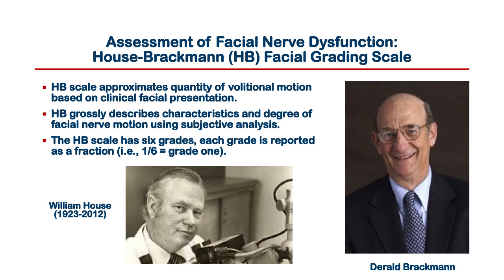Okay, now ENoG is performed with an evoked response system which has electrical stimulation. It's a very technical way of assessing the facial nerve, and in my opinion, extremely valuable. You can get information from ENoG you can't get any other way. And the otolaryngologists are not doing ENoG, so they're counting on you to tell them, is this nerve totally degenerated? And to monitor the patient to determine whether there's any return of function, because looking at the person's face and asking them to do things with their face, like smile or close their eye, only gives you a partial picture. It doesn't really tell you a lot about what's happening.